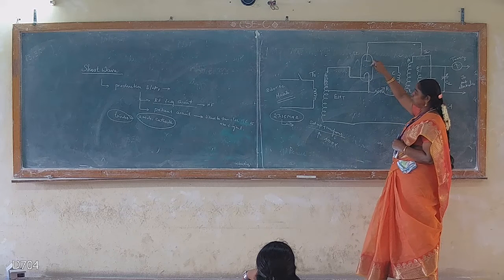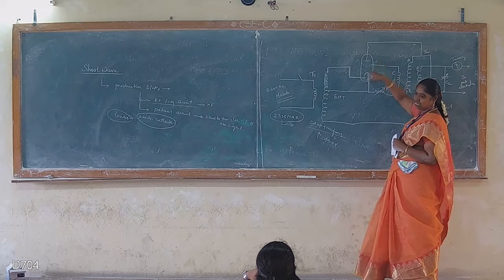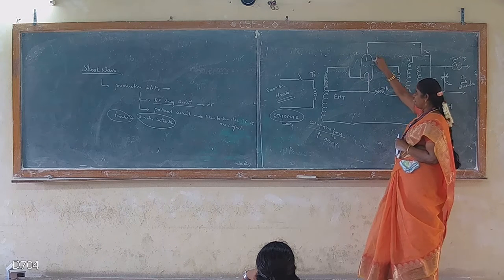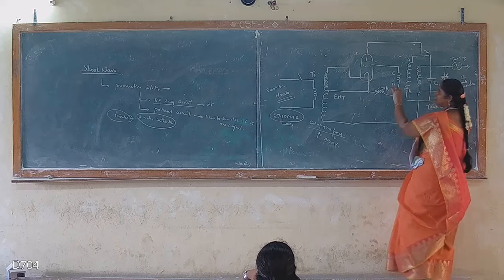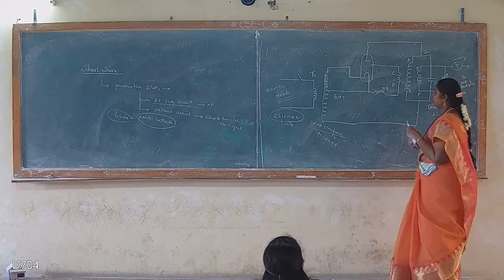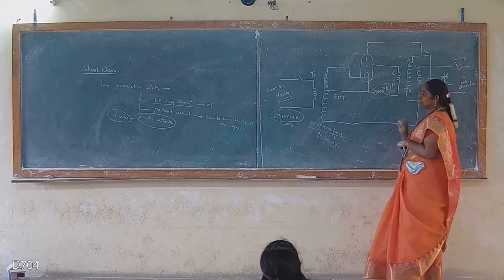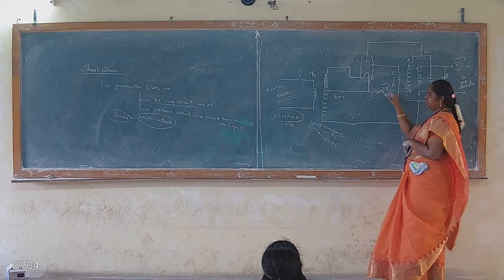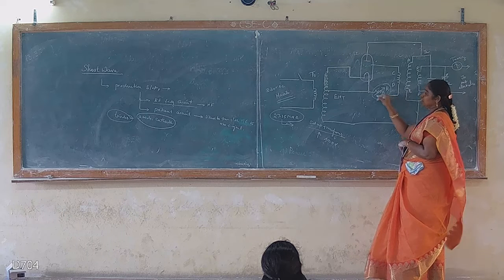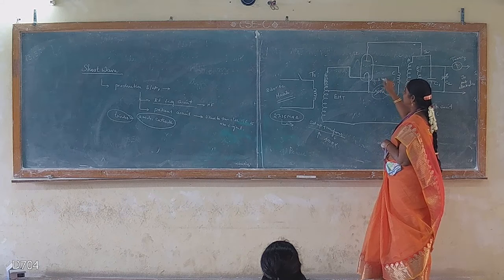Heating the filament is essential, because only then can conduction happen in this triode valve. So for heating the filament, the coil CD is used. And the purpose of having a resistance: here there is a variable resistance connected in series, mainly to adjust your grid bias.